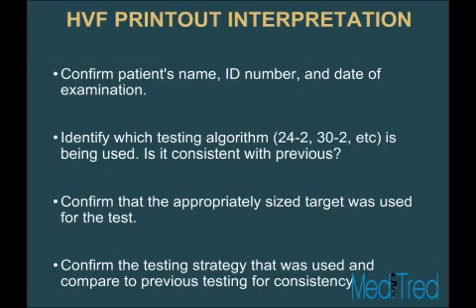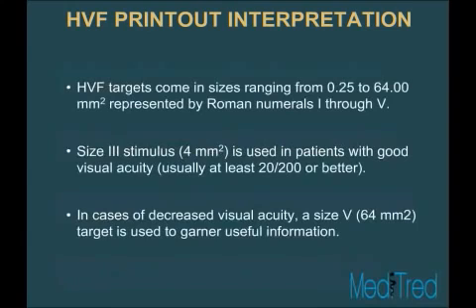Confirm that the appropriately sized target was used. So if you're using a size 3 target in one test, make sure that follow-up tests that are being compared are the same size target. And confirm that the testing strategy that was used is also the same as the previously used testing strategies.